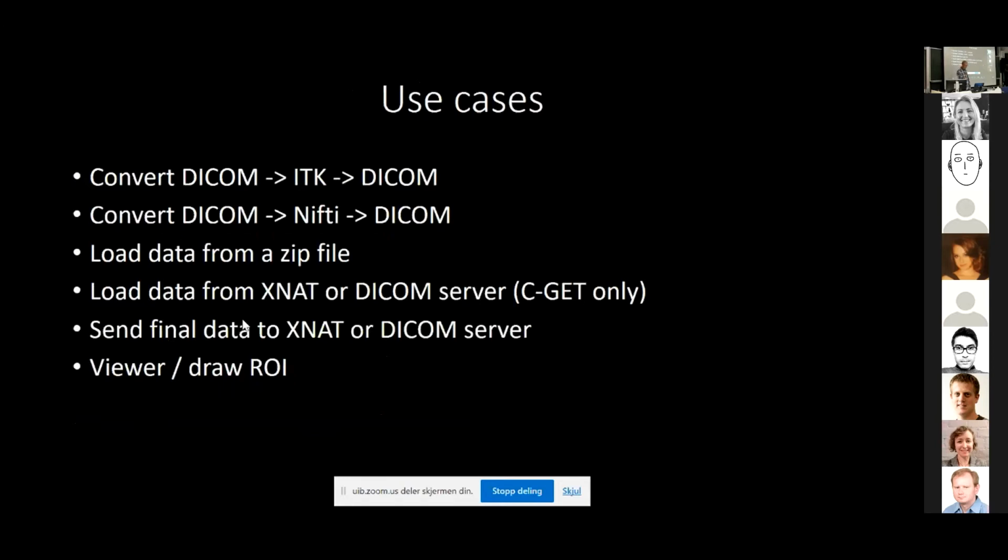And then, of course, we can never stop the project. We always find new ways of improving it, adding stuff, like loading files from a zip file and not just from a folder of images. Or you could load them from a server, either a DICOM server, which is a PACS system, or for instance XNAT, which we are using at the moment. And then also being able to return processed data back to, for instance, the DICOM server.